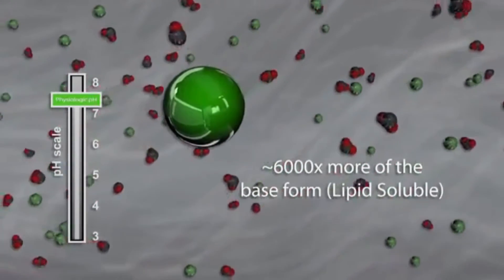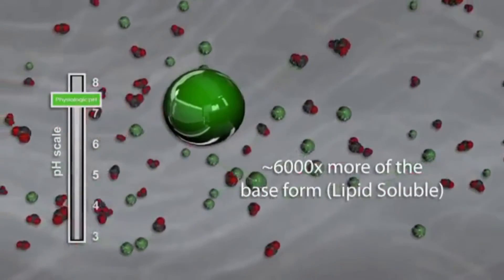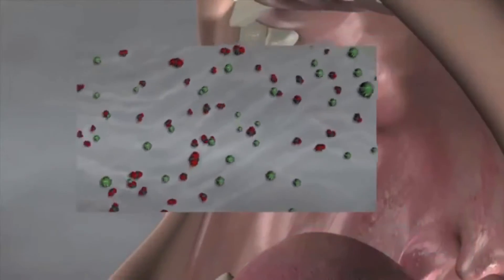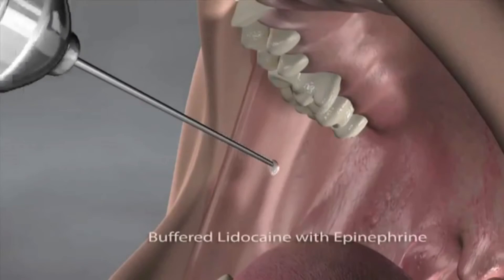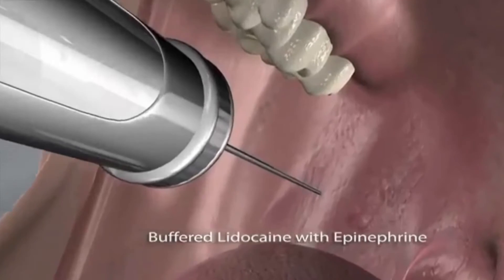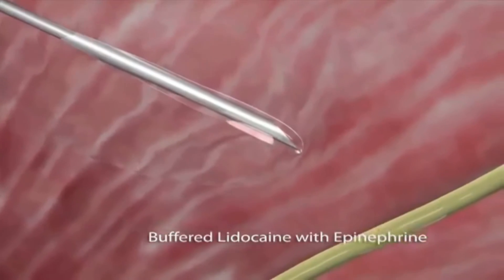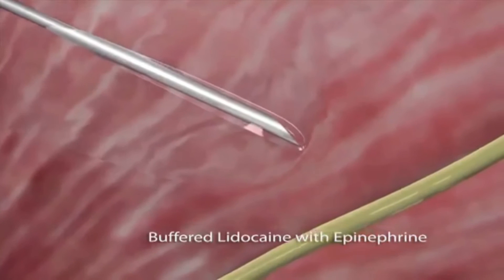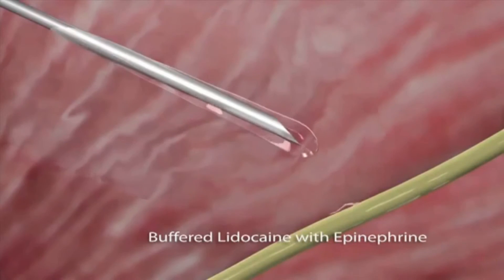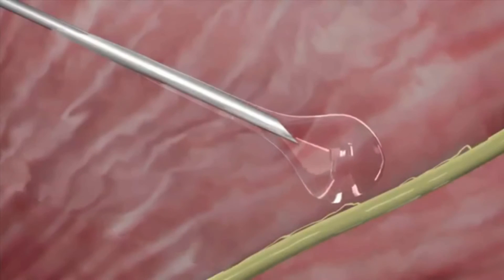Onpharma's sodium bicarbonate buffering solution predictably adjusts the pH and amount of CO2 in the local anesthetic cartridge to the Onset Target Zone. Once buffered to physiologic pH, the local anesthetic contains a high level of dissolved CO2 and 6,000 times more of the base form of the anesthetic. It is this base form that is lipid soluble and can cross the nerve membrane.